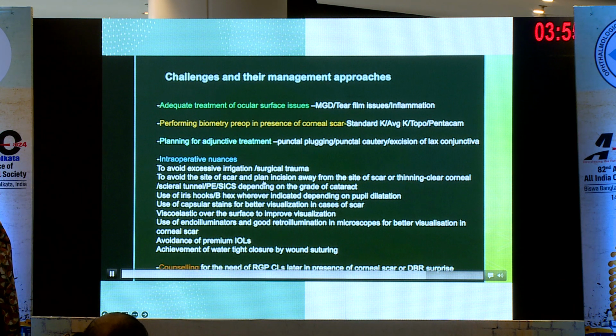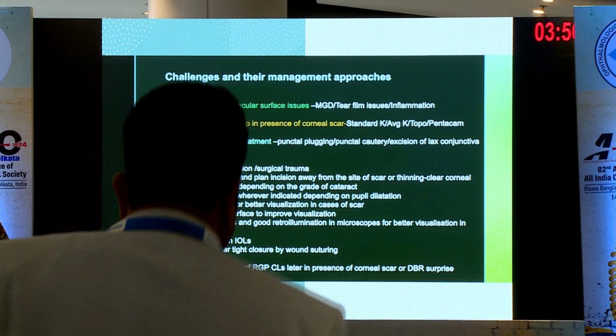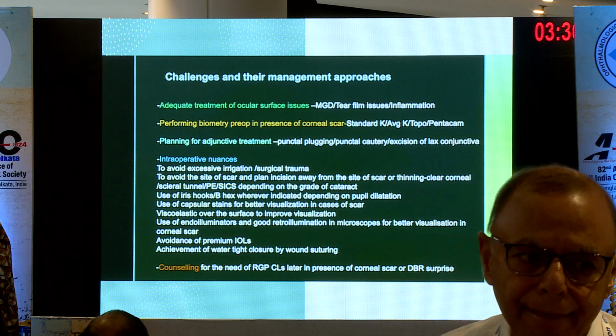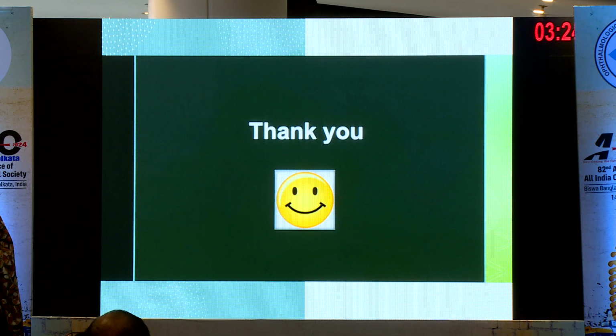Avoid the site of scar and plan the incision away from that site, use pupil expanders, use capsular stains for improving visualization, viscoelastic for improving visualization and magnification over the corneal surface, use endoilluminators and retroillumination in the microscope for improving visualization, avoid premium IOLs, and ensure watertight closure by being non-hesitant in taking sutures. Counsel these patients to use RGP lenses or spectacles post-operatively.